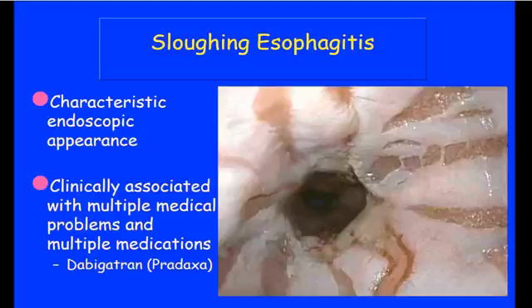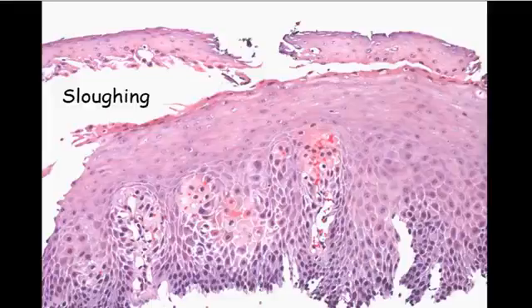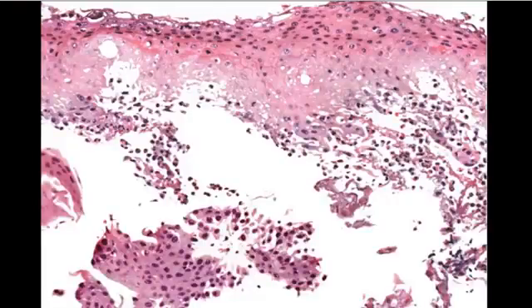Under the microscope, it's often got a two-tone appearance with very blue reactive epithelium on the bottom and then this sort of red stuff on the top that's sloughing off. And when you look at it, it's often partially necrotic. It's almost as if something came along and burned off the superficial layer of the squamous mucosa. And so it gives you that very two-tone look. And oftentimes where the split occurs, you'll get little aggregates of neutrophils, almost little micro abscesses, where the dead stuff is sloughing off from the top.